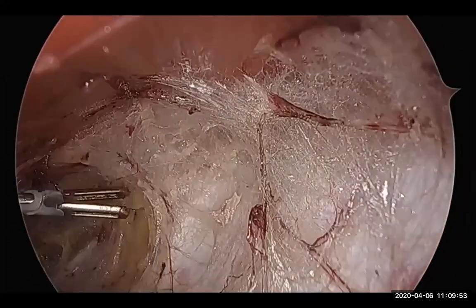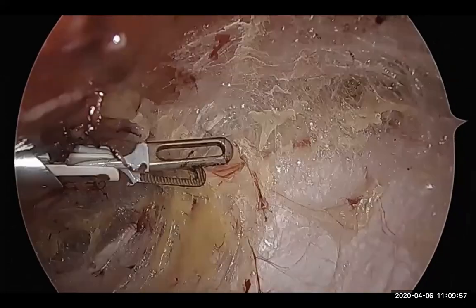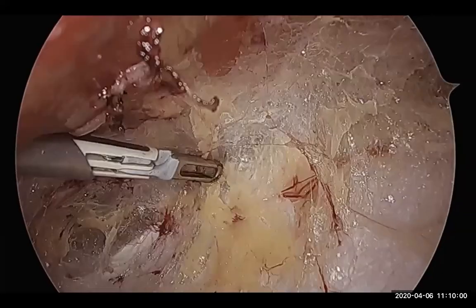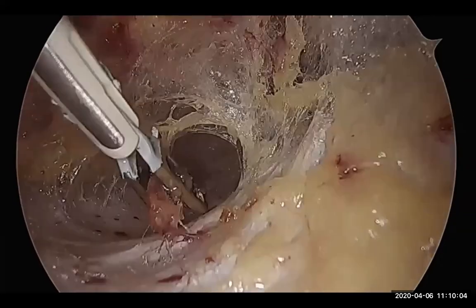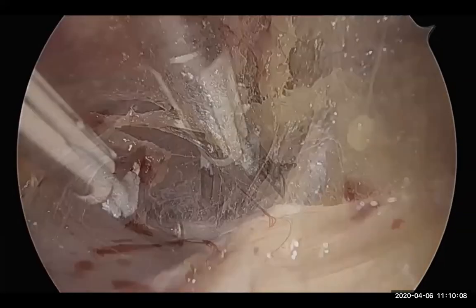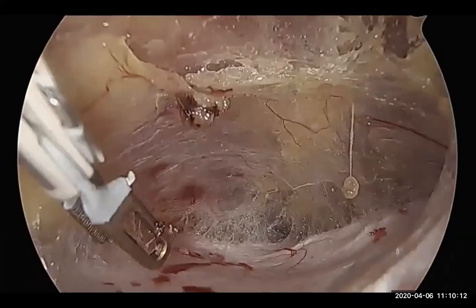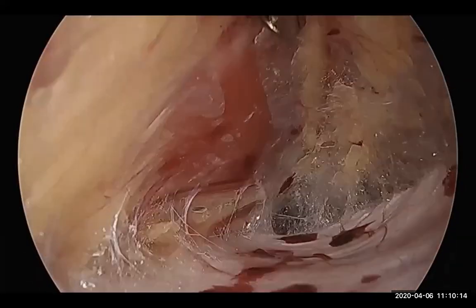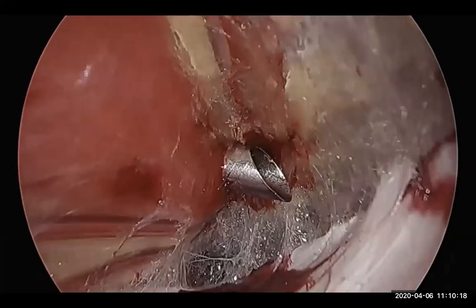That port is placed just medial to the linea semilunaris through the lateral part of the rectus muscle. You can use any device to create space. This is a bipolar instrument. It's not a seal cut, which is a very nice thing to use. This is simply a bipolar, and it is being used to divide the small vessels and make space for the third port. So this is the third port.